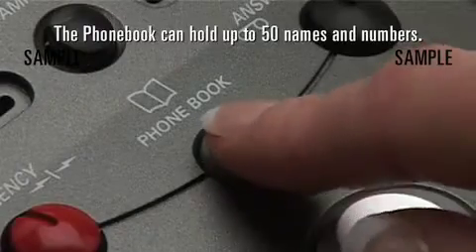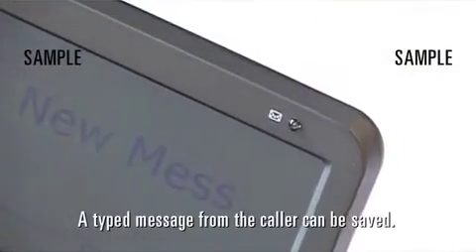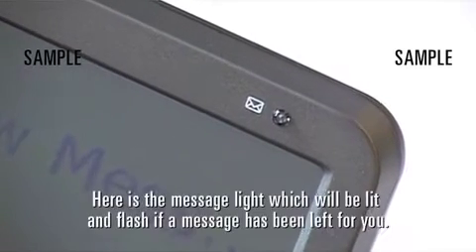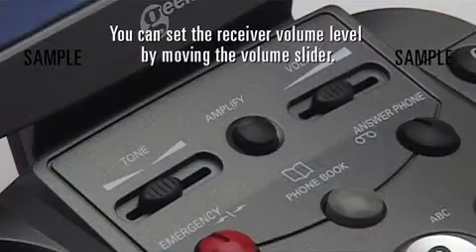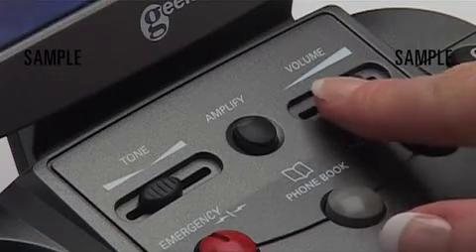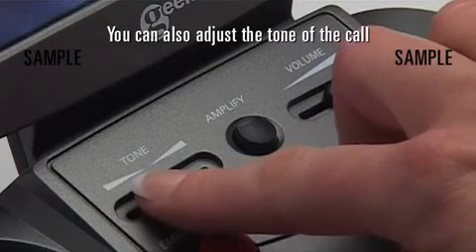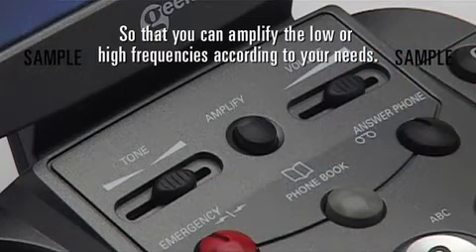The phone book can hold up to 50 names and numbers. There is an answer phone — a typed message from the caller can be saved. The message light will be lit and flash if a message has been left for you. You can set the receiver volume level by moving the volume slider, and you can also adjust the tone of the call to amplify low or high frequencies according to your needs.